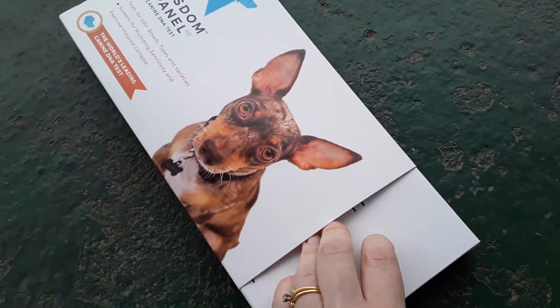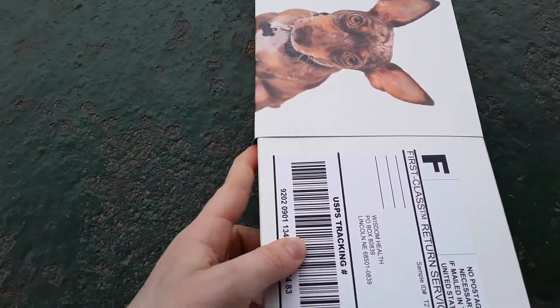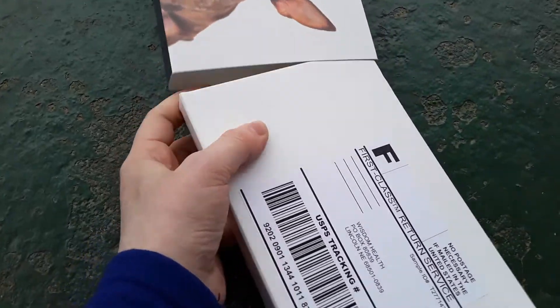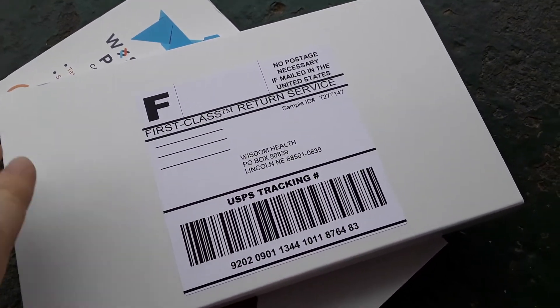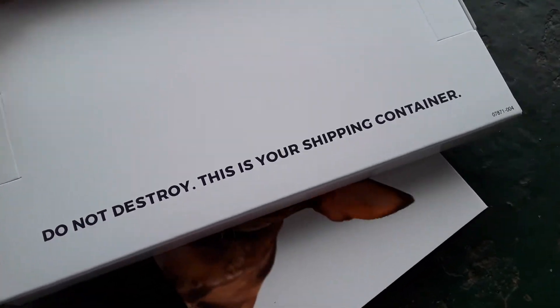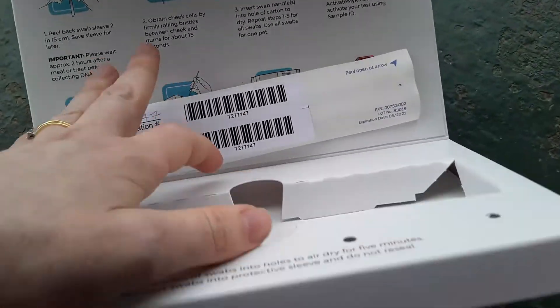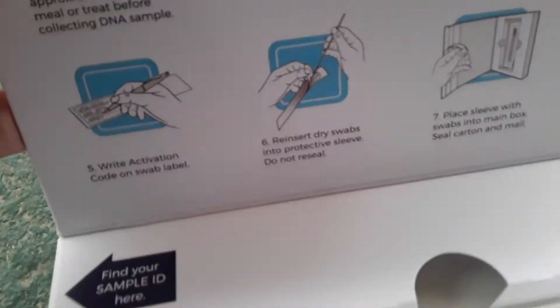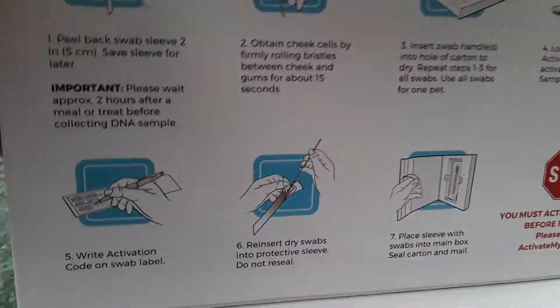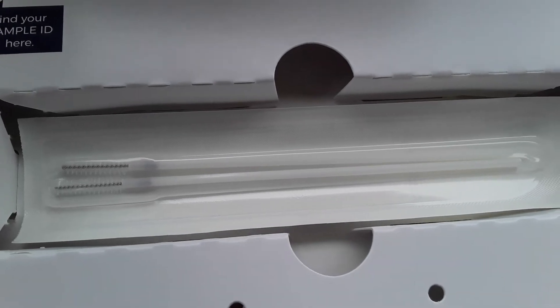So I want to go ahead and show you exactly what you're supposed to do with your Wisdom Panel test. You're going to open it and you'll see that inside is your return box, which already has tracking on it. It tells you do not destroy this — this is your shipping container — so you're going to ship it back exactly the way it is.